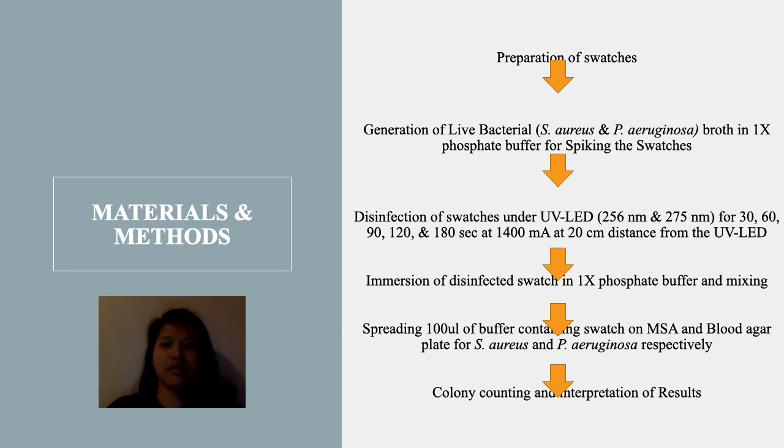We disinfected said spiked personal protective equipment for 30 seconds, 60 seconds, 90 seconds, 120 seconds, and 180 seconds at a fixed current of 1400 milliamperes and 20 centimeter distance from the UV LED.